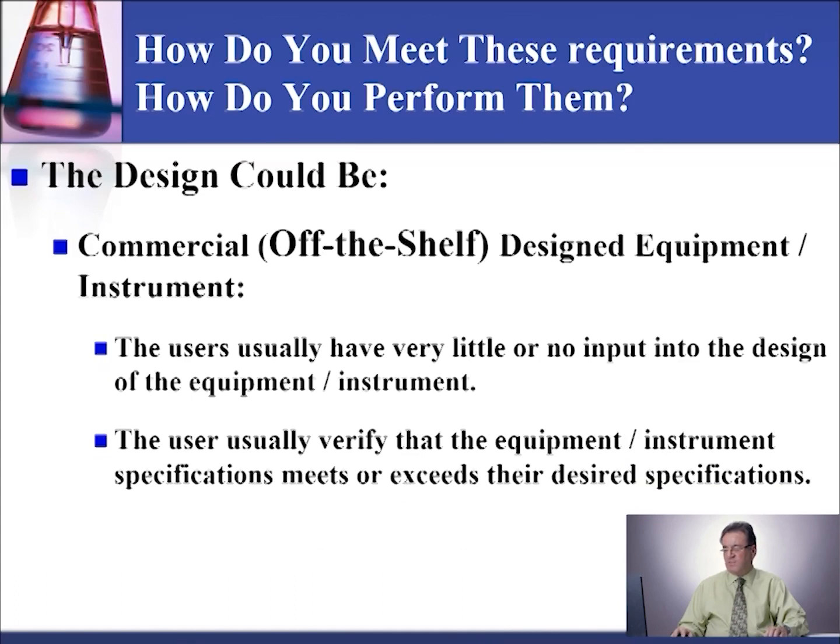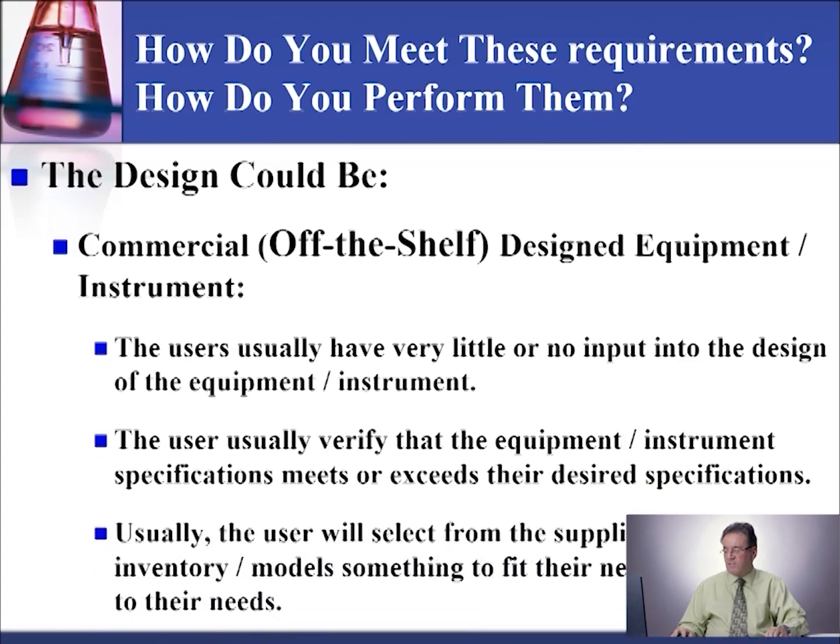What else you need to do? You need to do calibration for the different tests that you are going to report patient results on. You need to run it as required by the manufacturer or lab policy. You also need quality control, run and documented as required by the manufacturer, accreditation body, or your lab policy.